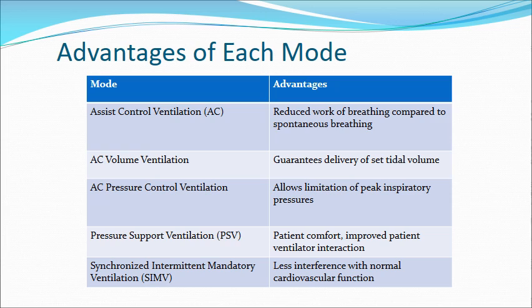Think of that in electronics terms as like having a blanking period where the patient is able to breathe on their own if they can, and the machine won't interfere, but if they don't, in that period, the machine will take over. But it has the advantage that the patient can return to normal breathing at their own rate, their own volume, their own characteristics for those voluntary breaths with less interference in the cardiovascular function.